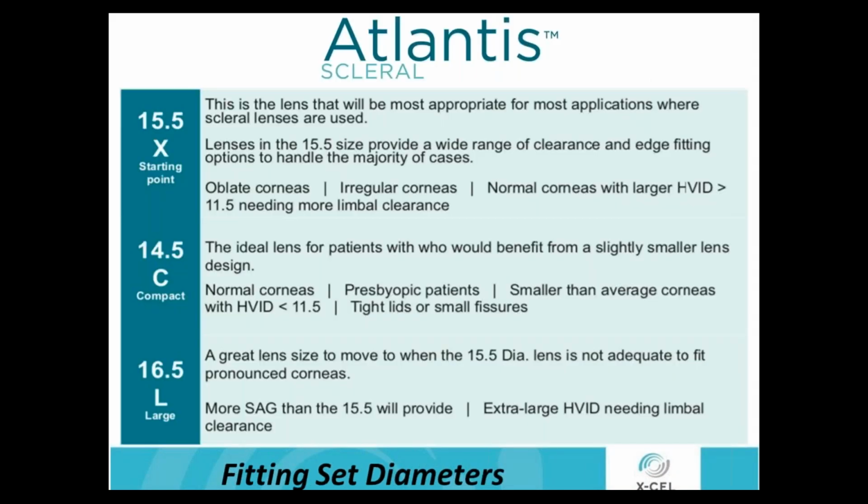with the fitting. So as we get into the fitting philosophy, again, this is our philosophy, and I'll give you the reasons why we chose what we chose as our philosophy. And it may differ from other sets or even practitioners or colleagues that you've talked to. So we have 2 generations of our Atlantis design. Generation 1 is where we started, and again, we had that out for about 7 years. And this year, we introduced Generation 2.